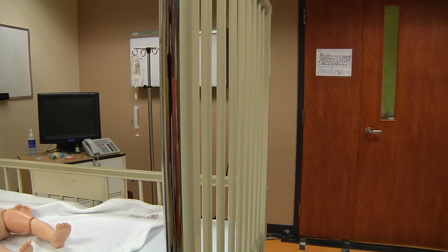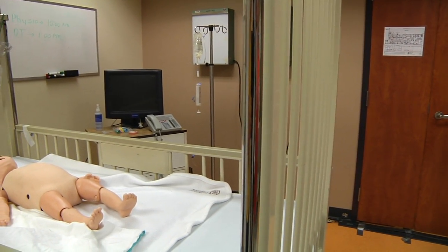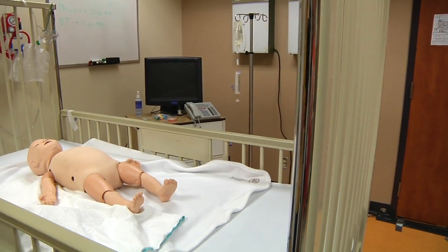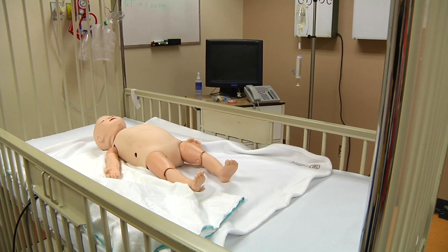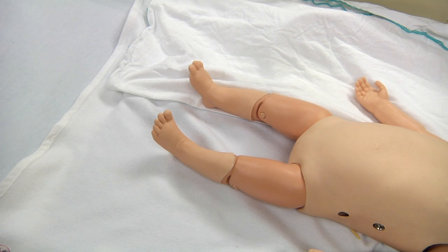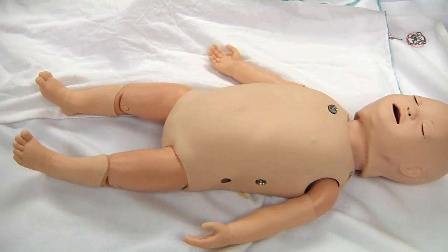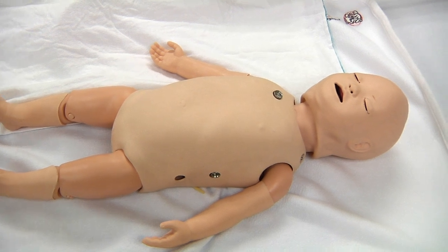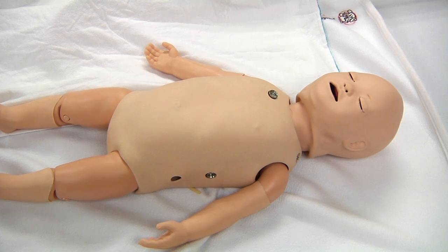To make each learning opportunity as valuable and meaningful as possible, it is important that you understand the capabilities of your patient simulator, along with the expectations for your actions during a medical simulation. This video will introduce Laerdal's SimBaby, a computer-controlled, full-body, high-fidelity infant mannequin. It has realistic anatomy and clinical functionality that allows for a variety of medical assessment and intervention techniques.